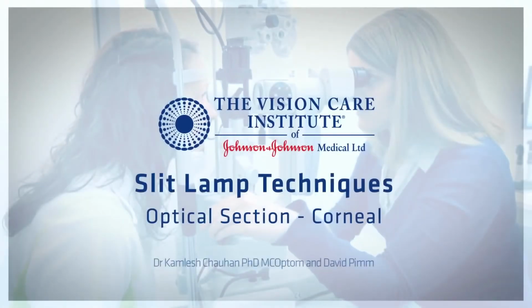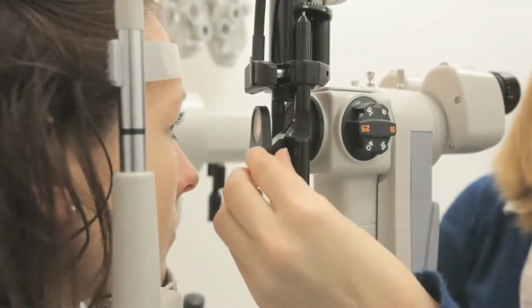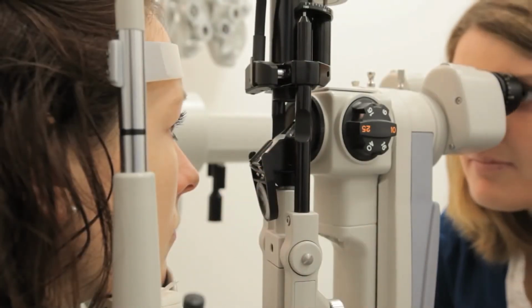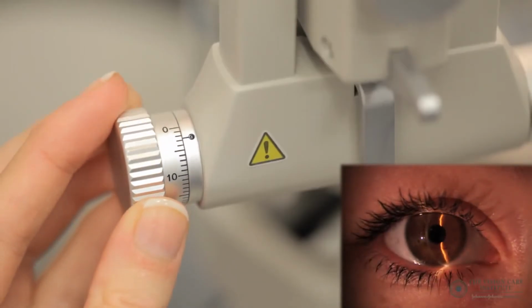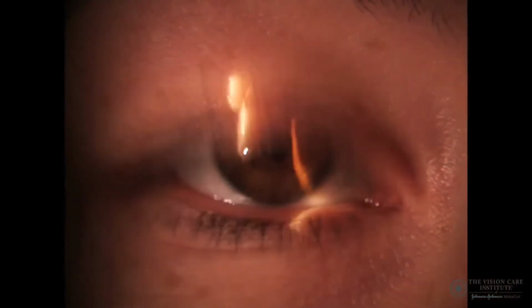A really useful technique to carry out is an optical section. In this case, we're going to look at the optical section of the cornea. This is an effective way to examine the depth of any corneal damage. If we have the diffuser in place, we should remove this, being mindful of the amount of light entering the patient's eyes. To begin with, we want to thin the slit down as much as we possibly can, which will allow us to get good resolution of the section.